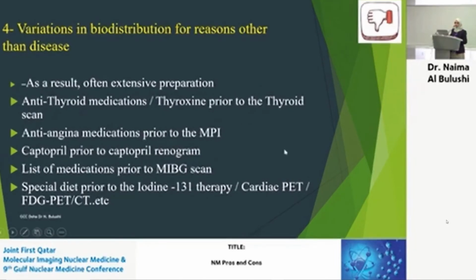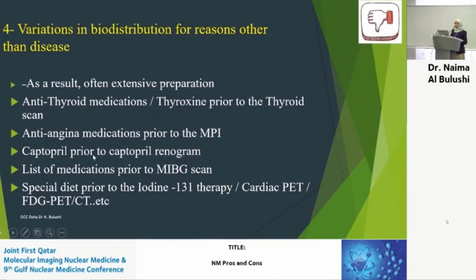So a lot of preparation is required, and this is to be incorporated in your manual or in your SMS when you send it to your patients, what to do prior to the scan, so that you don't have to postpone, you don't have to cancel, like the anti-thyroid medications, the anti-angina medications, the captopril that you have to suspend before captopril renogram. We have a list of medications that we have to share and update and share with our referring endocrinologists and endocrine surgeons prior to doing MIBG scan.